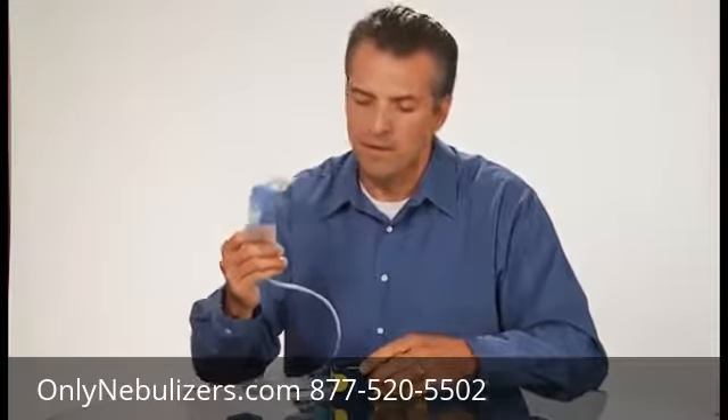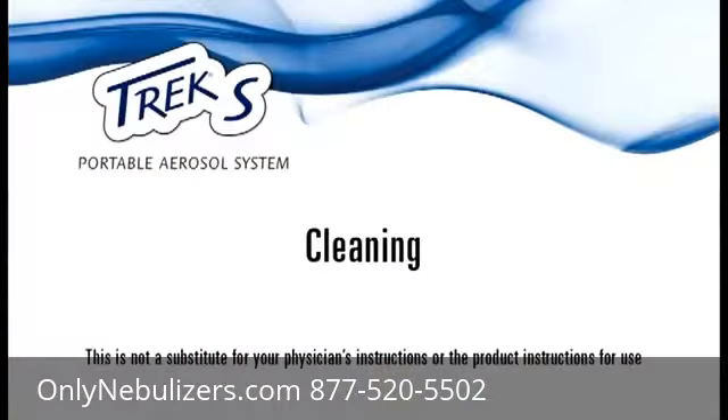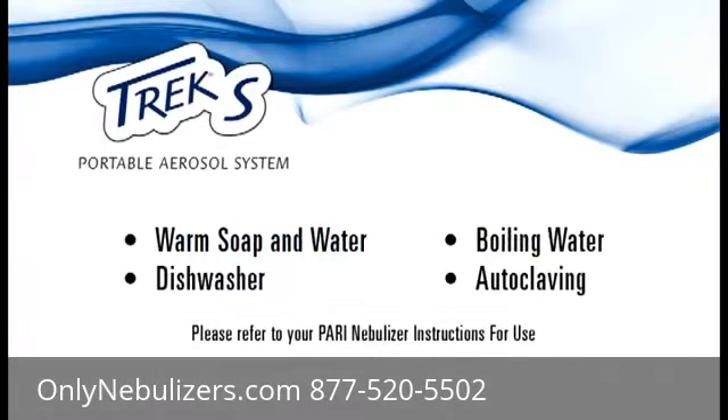Then turn the power switch off. When you have finished with your treatment, be sure to follow your nebulizer and physician's instructions for proper approved cleaning and disinfecting methods. If you have questions, ask your physician or call Pari's patient connection at 1-800-FAST-NEB. Your Pari reusable nebulizer cup can be cleaned and disinfected using these easy methods: with warm soap and water, in a dishwasher, with boiling water, and by autoclaving.